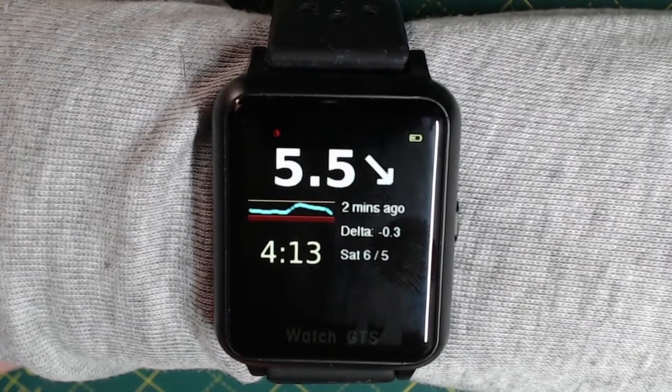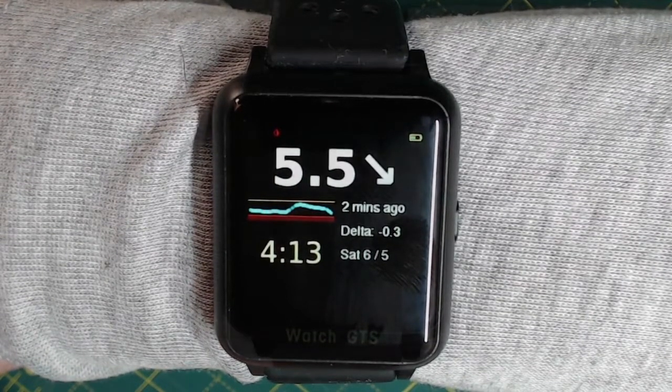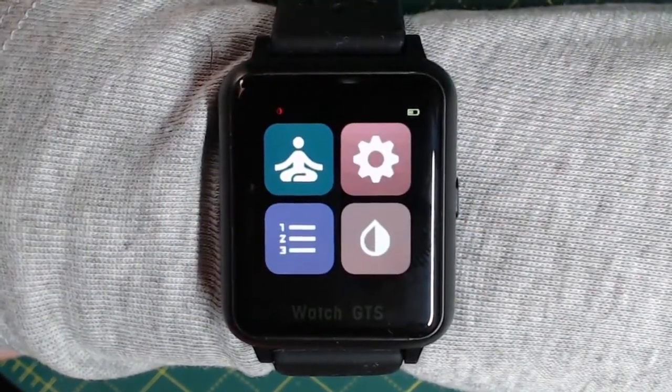One thing I should mention is that you can also use the side button to illuminate the display. Press it once to illuminate the display and press it twice — you double tap it — to bring up the menu.